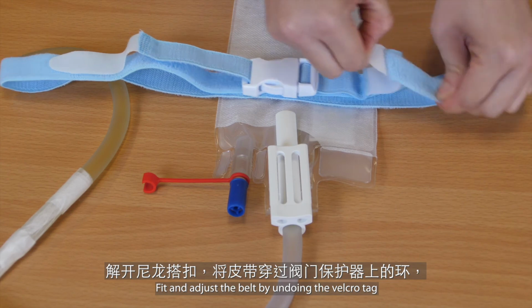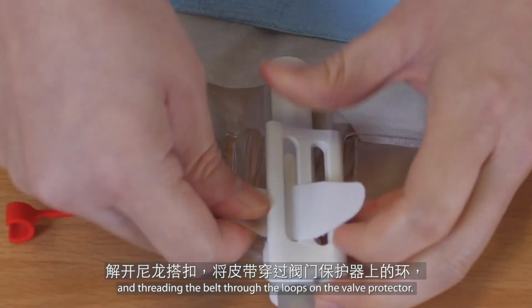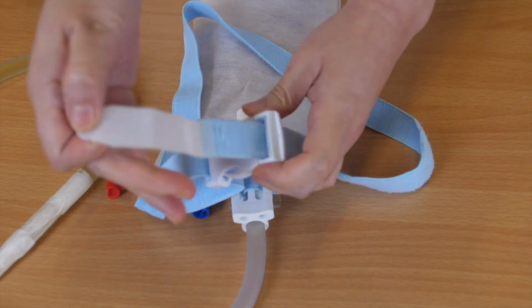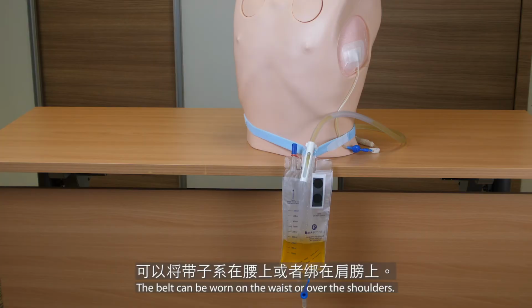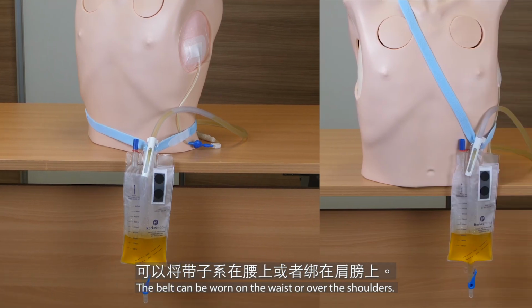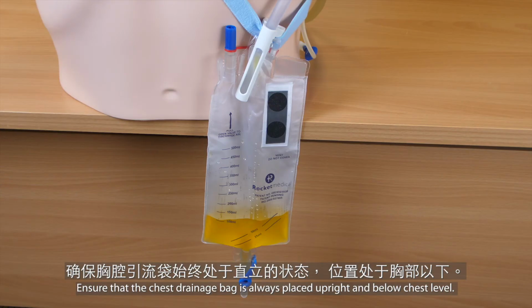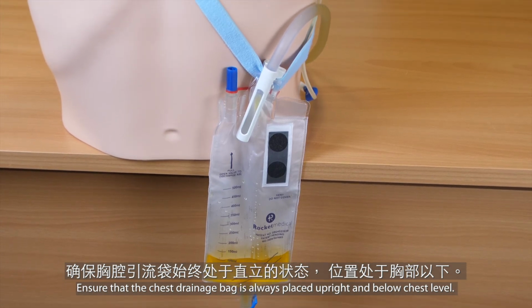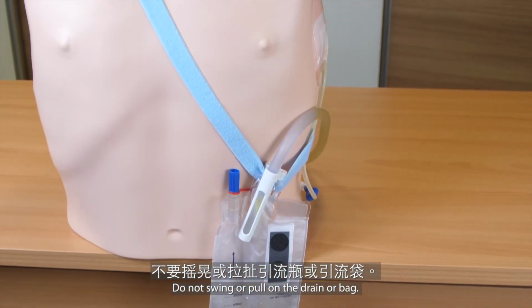Fit and adjust the belt by undoing the Velcro tag and threading the belt through the loops on the valve protector. The belt can be worn on the waist or over the shoulders. Ensure that the chest drainage bag is always placed upright and below chest level. Do not swing or pull on the drain or bag.